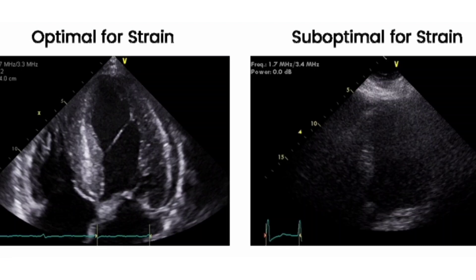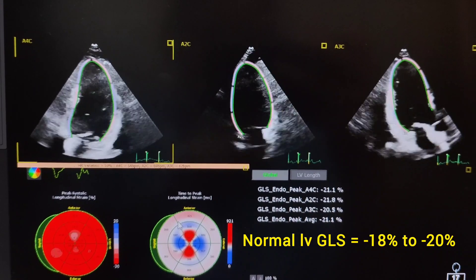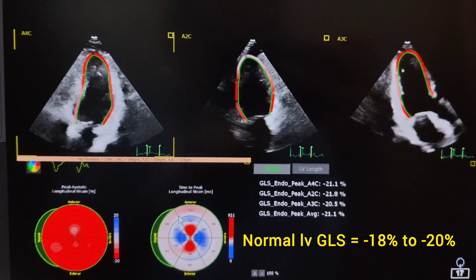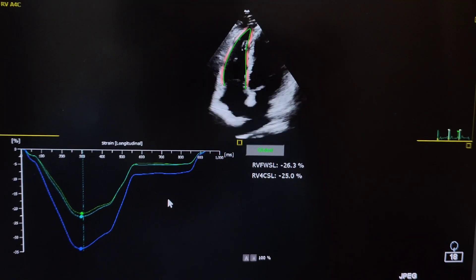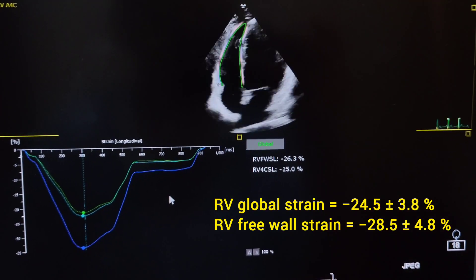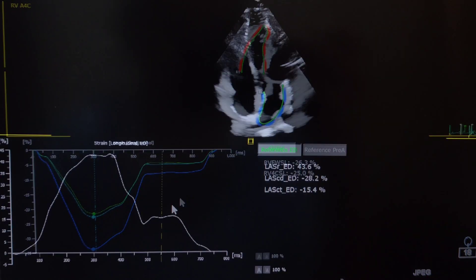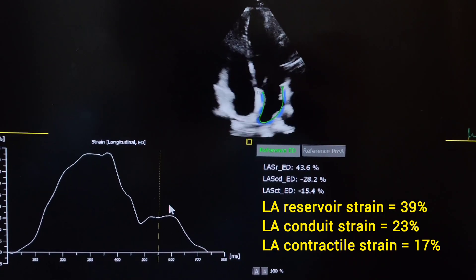Optimization of echo images while performing GLS is one of the most important aspects. One should acquire chamber-focused images in order to perform GLS. For better understanding, here are some real-time images. LV GLS normal value ranges between minus 18 to minus 20%. For RV GLS, normal value ranges between minus 25 to minus 28%.